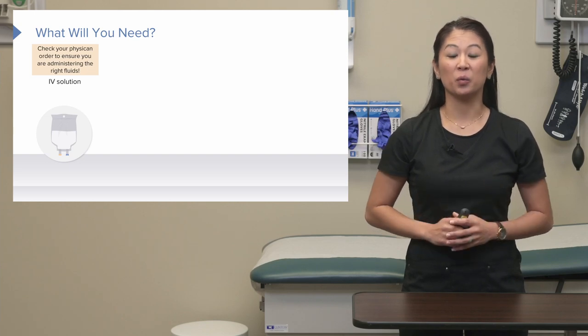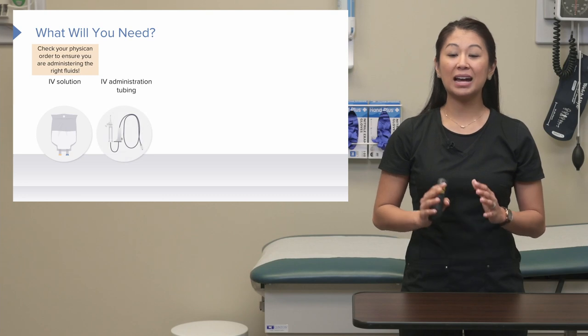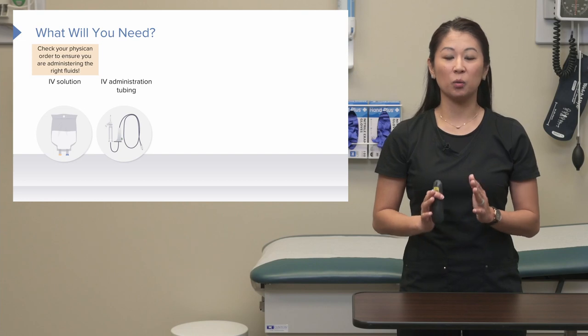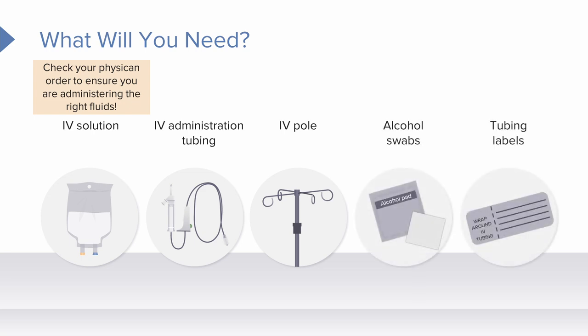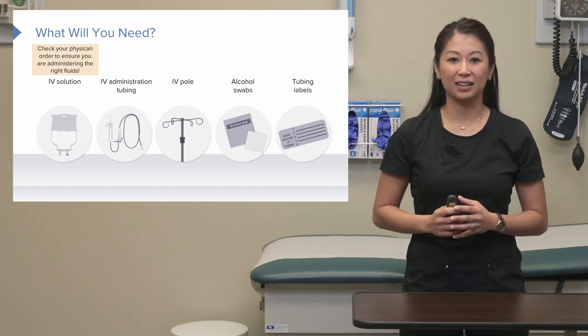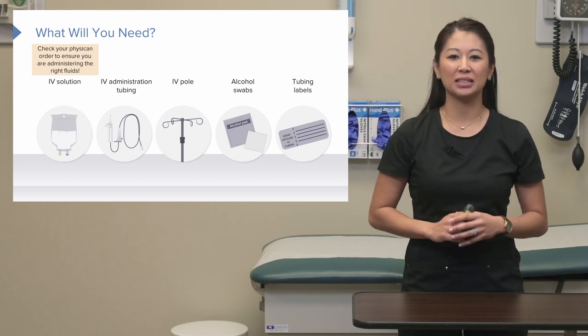Now let's take a look at the equipment we're going to need. We need the solution itself, IV administration tubing — make sure you get the right tubing, which we call primary tubing — an IV pole, alcohol swabs, and a tubing label. Each facility is a little different, but these labels help us track how long the tubing has been hanging. Most agencies say about 72 hours, but check your facility policy.